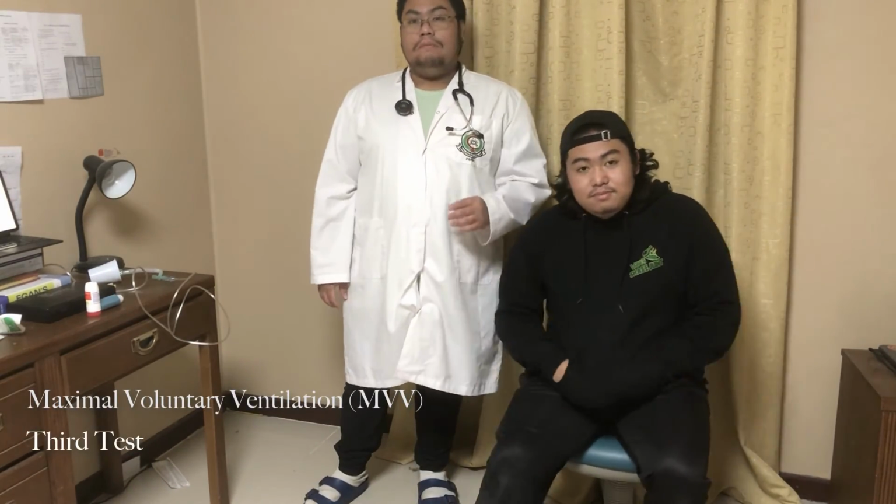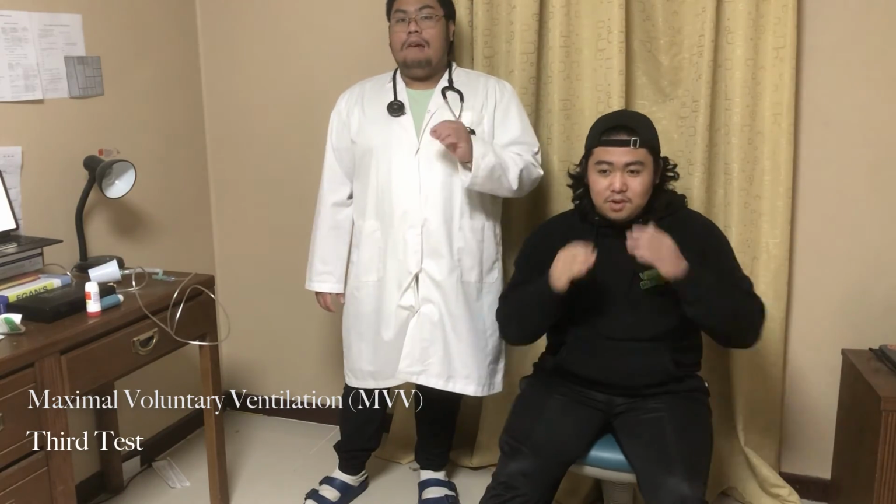So that was a successful FVC, and we're going to obtain at least 3 samples of it in an actual SVC test. Now, give your patient sufficient rest, and we're going to be doing the next step of the PFT test, which is MVV. So after giving the patient sufficient rest for them to obtain maximal effort, now we're going to be moving on to our next test, the MVV.